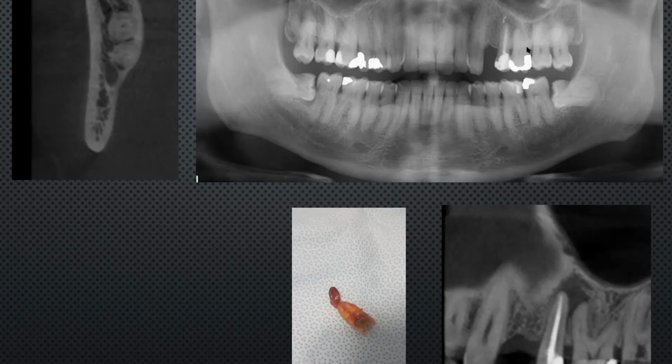If I'm concerned that there's going to be a need for guided bone regeneration at both sites, then I will tend to do my relieving incisions in a controlled way. You've got to really try and diverge the incisions so that you maintain the vascular pedicle to the narrowest part of the flap, which is at the crest of the ridge. And so that your incisions are away from where you're grafting. You don't want your mucosa to be laid down on top of where the graft is.